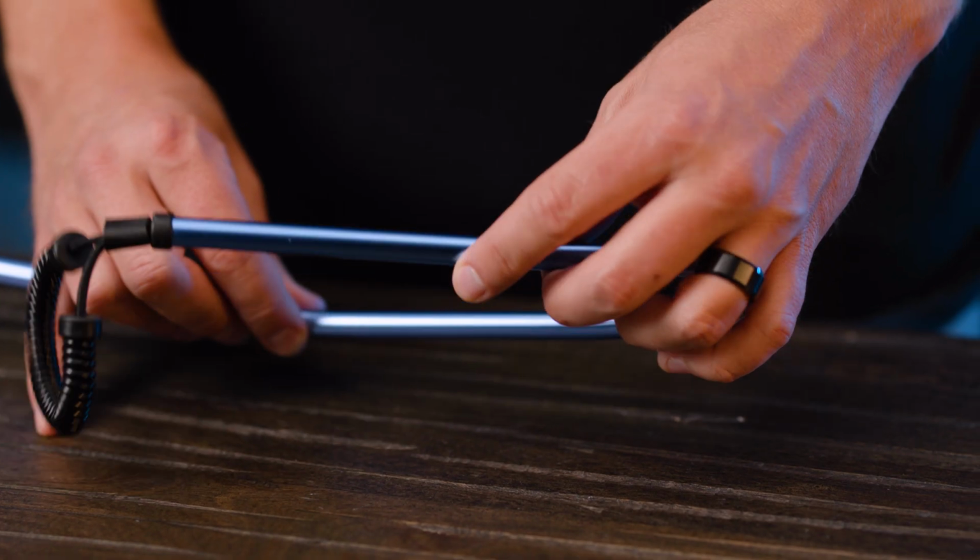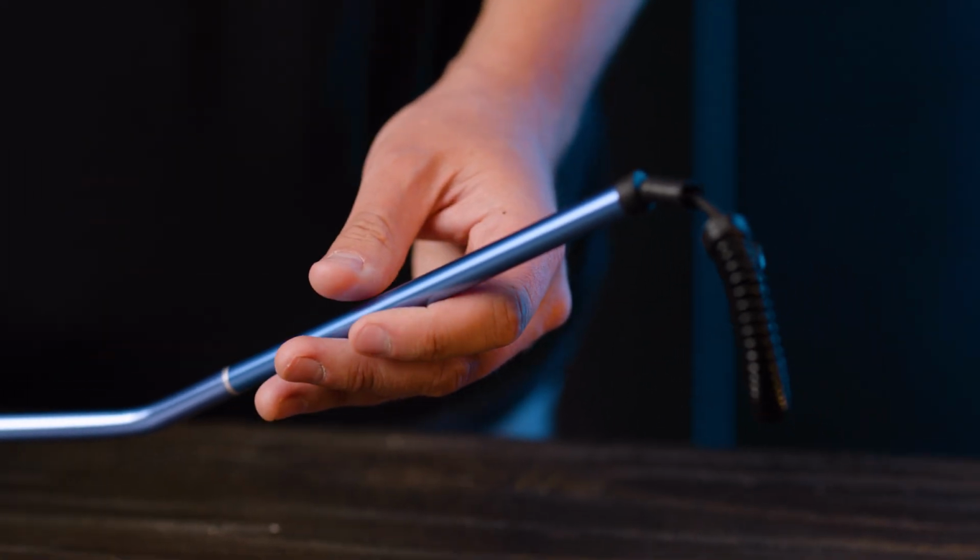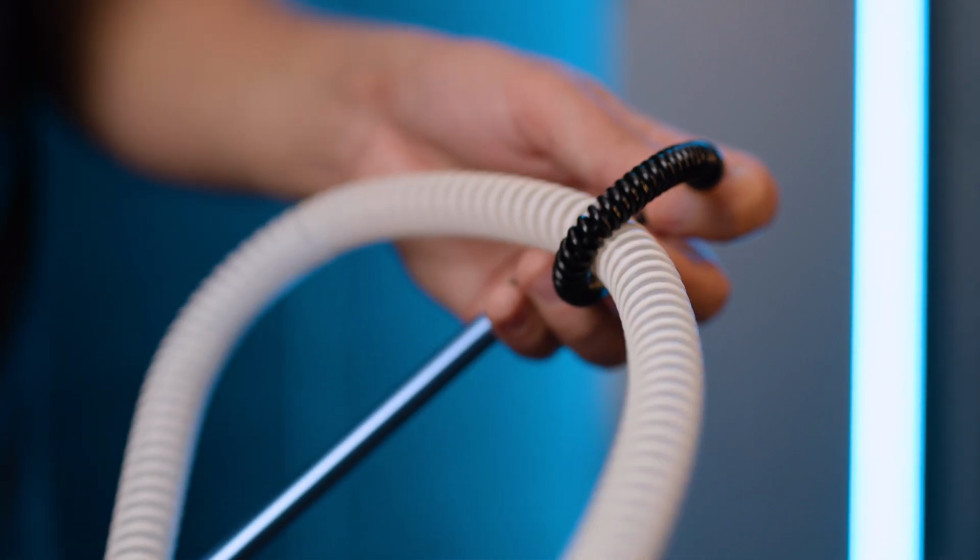For those that need a longer hose, it can be helpful to invest in a tube management system as well. There are stands with hooks that attach to your bed and raise your tubing. This makes sure the tubing goes from your head up to the tube lift, around your bed and away to the machine. This can help avoid the tube getting tangled, knotted, or wrapped around the furniture as you night roam the bed. But in the end, the tube length question doesn't have to be final.